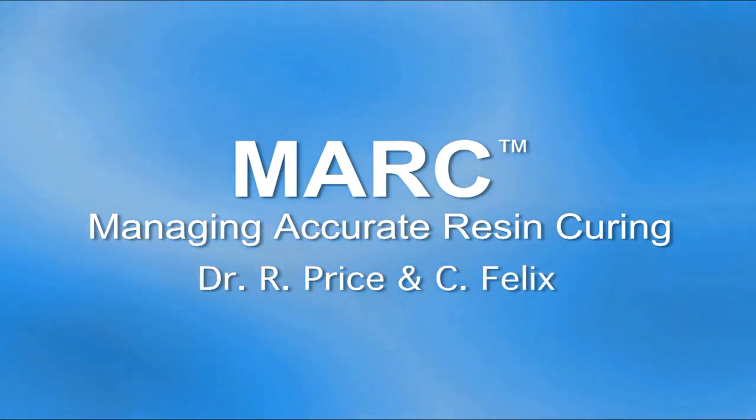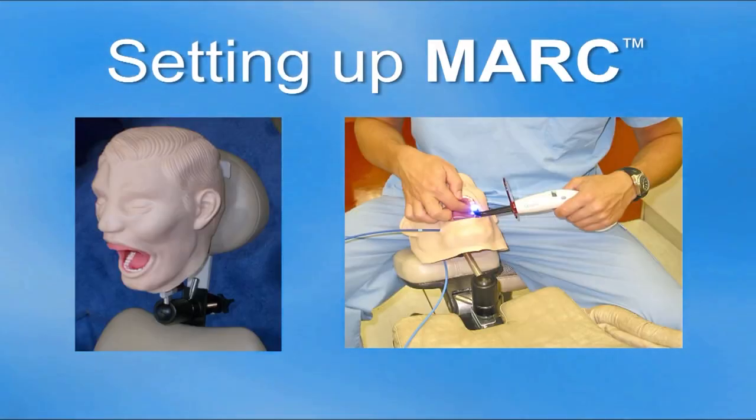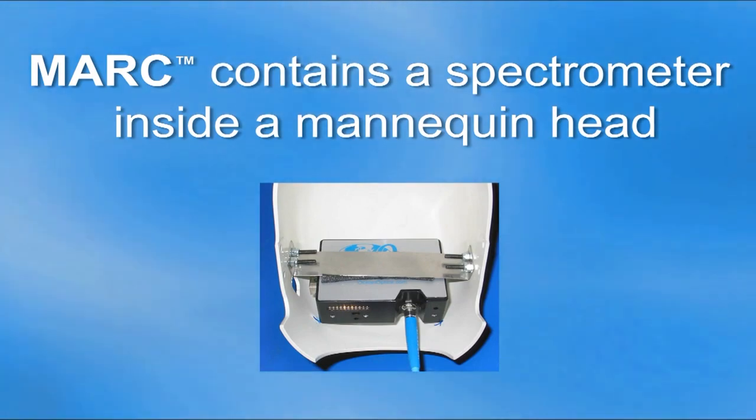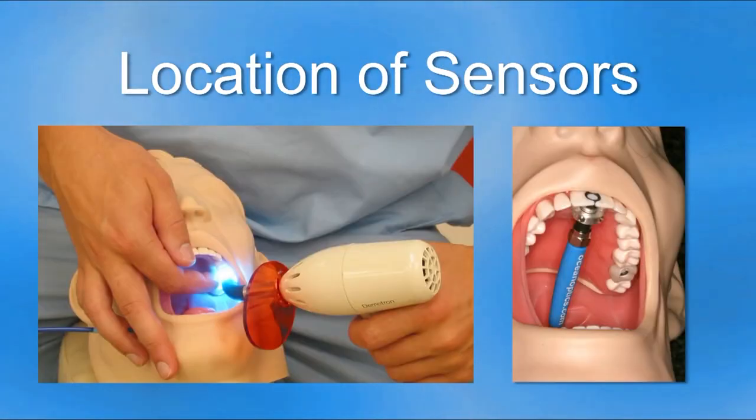This video shows how MARC is set up, attached to a dental chair, and the location of the sensors. MARC contains a laboratory-grade spectrometer inside a mannequin head. Here we can see the sensors are located in the anterior and the posterior regions.